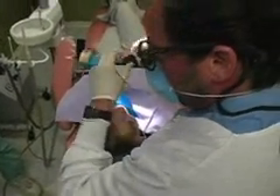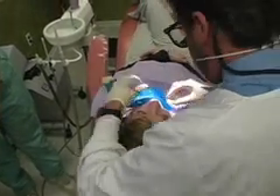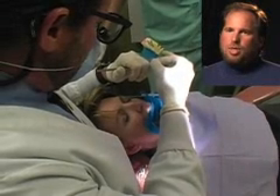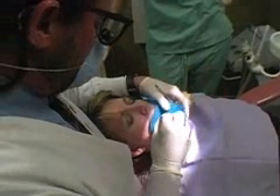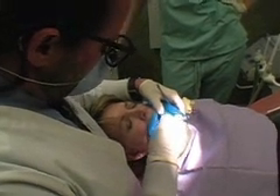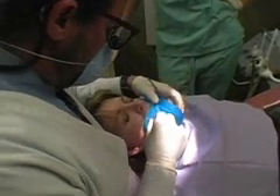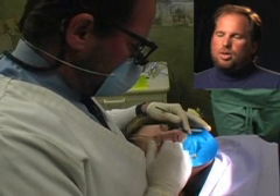We still also use hand files, which you see me using here, to verify the length of the root during the procedure and also to keep things clean. We use a combination of both the rotary handpiece-driven files and the hand files. I'm using lubricant on the files to help clean and shape the root canal. I also put a little topical anesthetic on the file, which helps if there's any part of the tooth that is sensitive — it numbs the tooth even more so the patient feels no pain during the procedure.